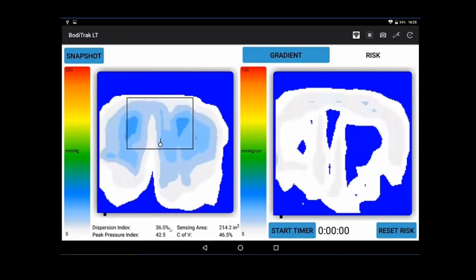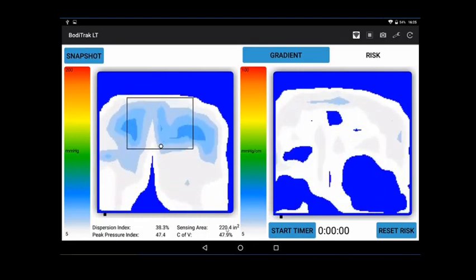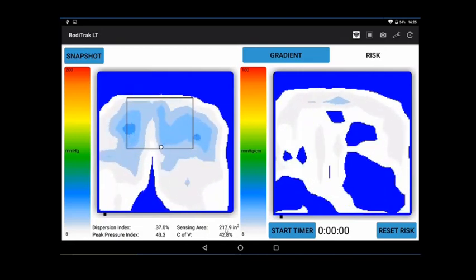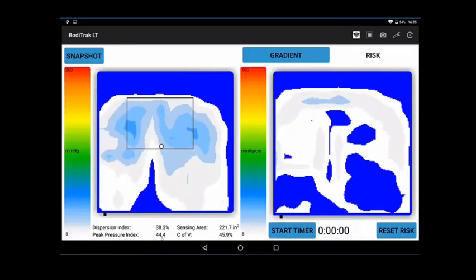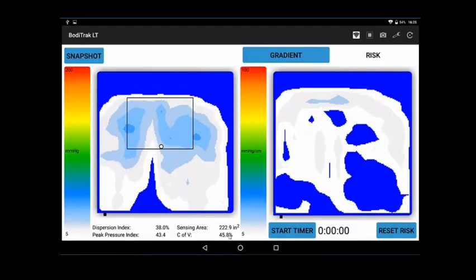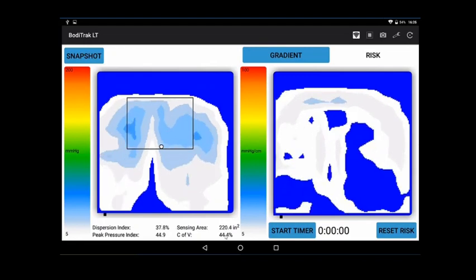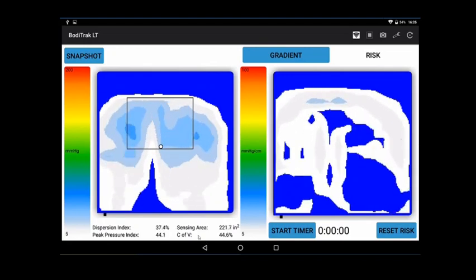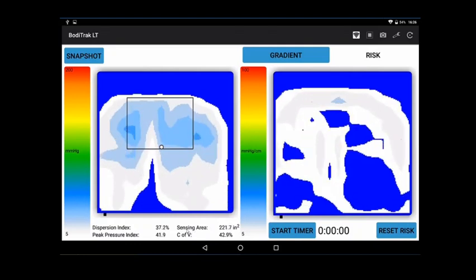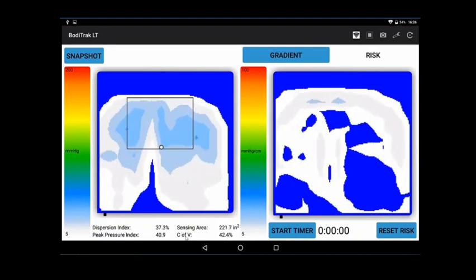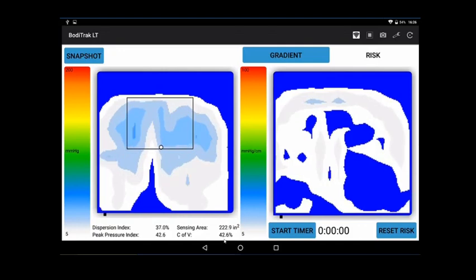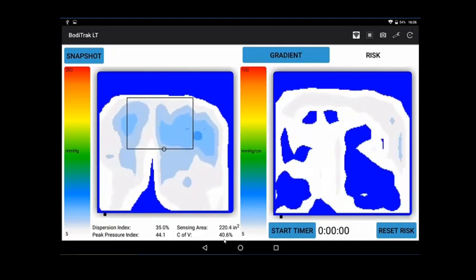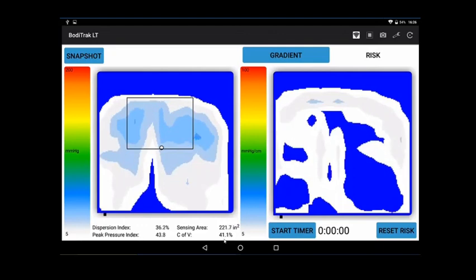You also have contact area or sensing area, the area in which the person is contacting the seat, the peak pressure index, and the coefficient of variation. The coefficient of variation is a flatness indicator showing how evenly we've distributed the pressure. If sensing area goes up, typically the coefficient of variation will go down, unless you've got a spot that's really landing hard on the cushion that's asymmetric.